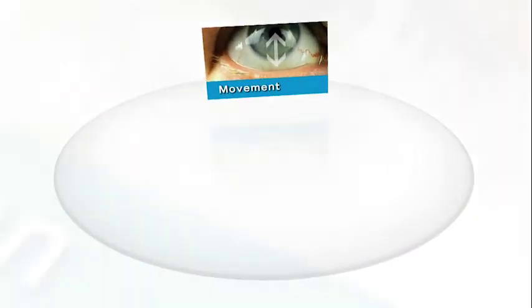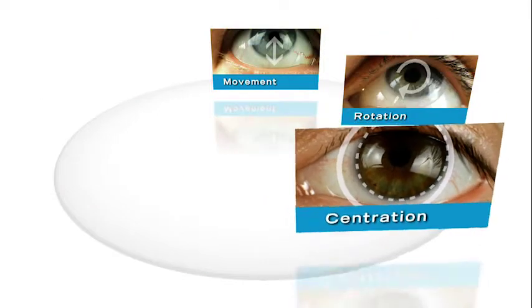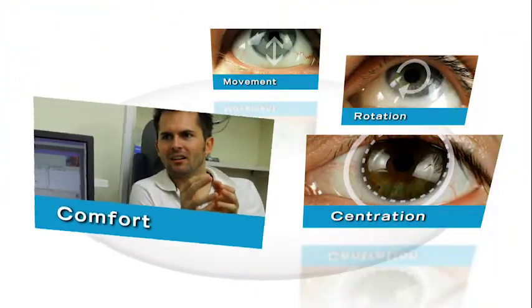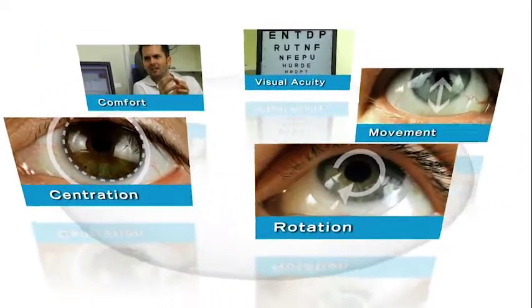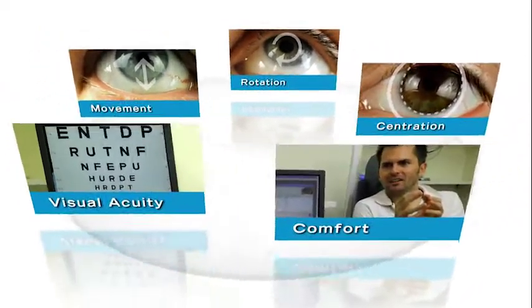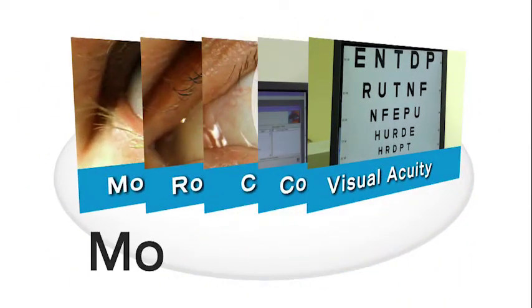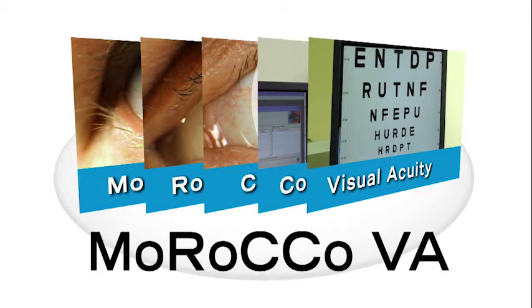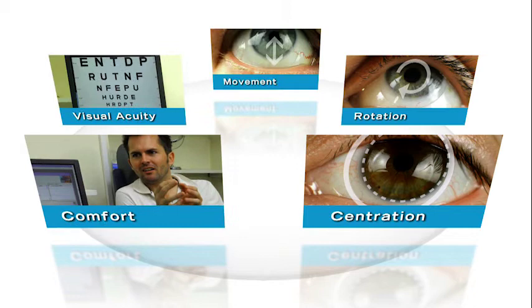The overall best fit is determined by assessing 5 key characteristics of lens performance. These are movement, rotation, centration, comfort, and visual acuity. These are the key building blocks that determine the KeraSoft IC lens fit and are easily remembered by the acronym Morocco VA. Each of these form an integral part of the complete fit, and therefore they must be assessed together.